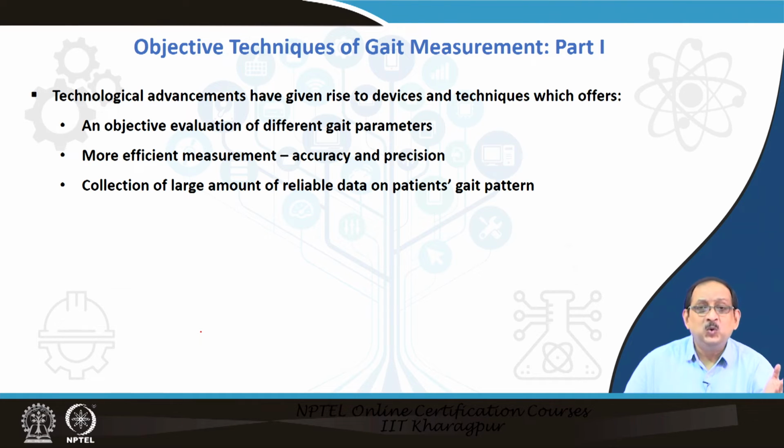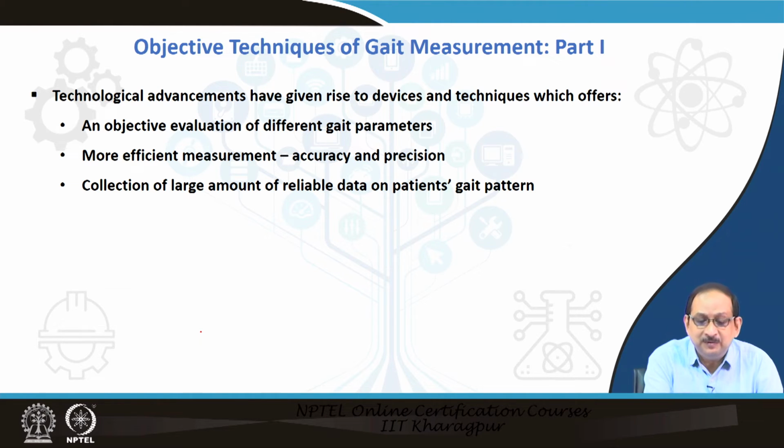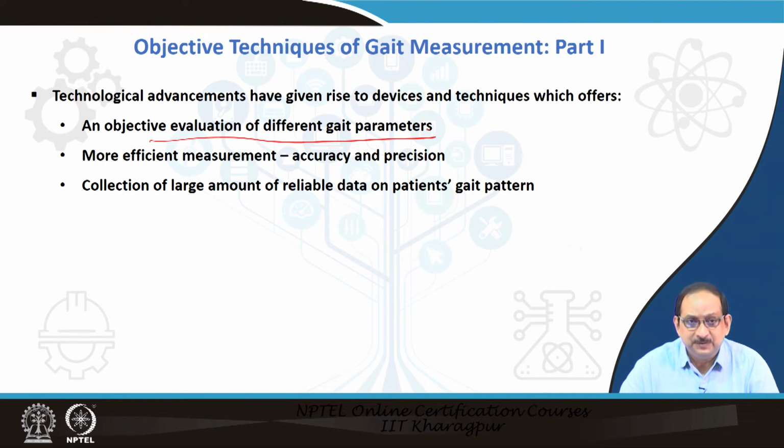Now, as you all know, technological advancements have given rise to devices and techniques which offer an objective evaluation of different gait parameters.